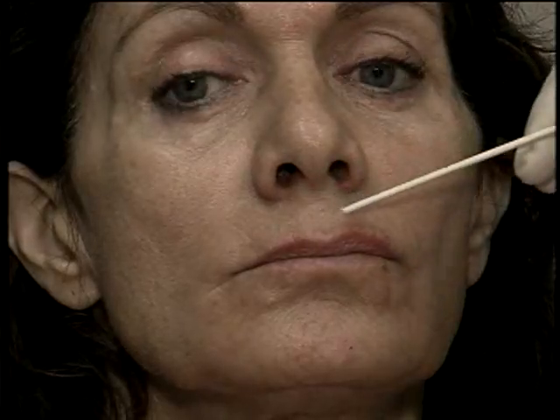The lips are another nice area to treat with the hyaluronics. I think they work very nicely here. It's a very natural appearance. It will help break up some of these fine lines as they reach the vermilion. So I will place a threading method around the lips, and I'll show you those techniques. And that's another area to treat well in combination with a neurotoxin.